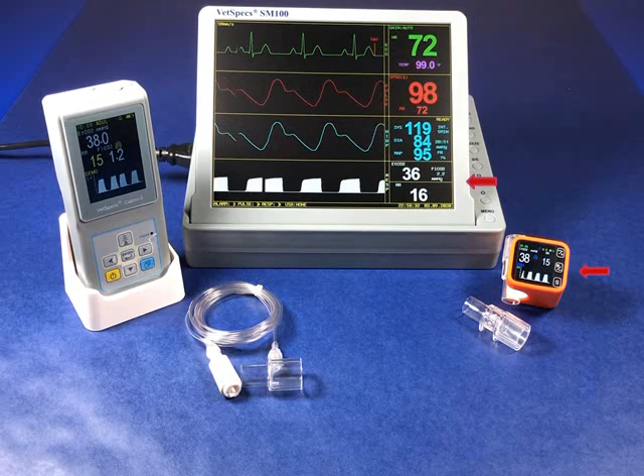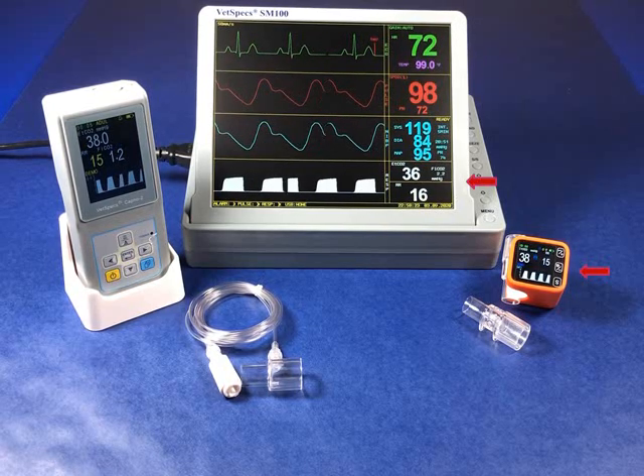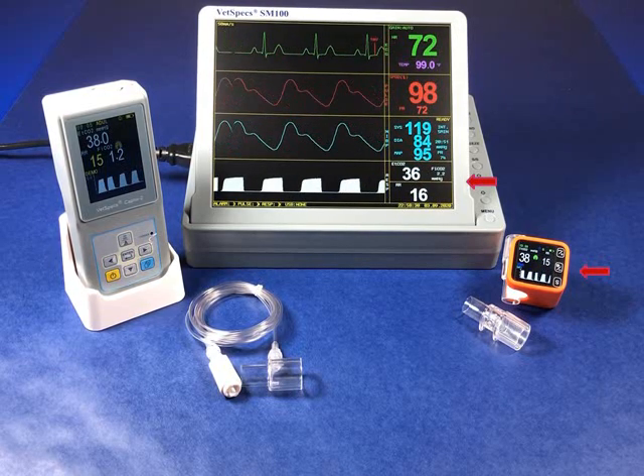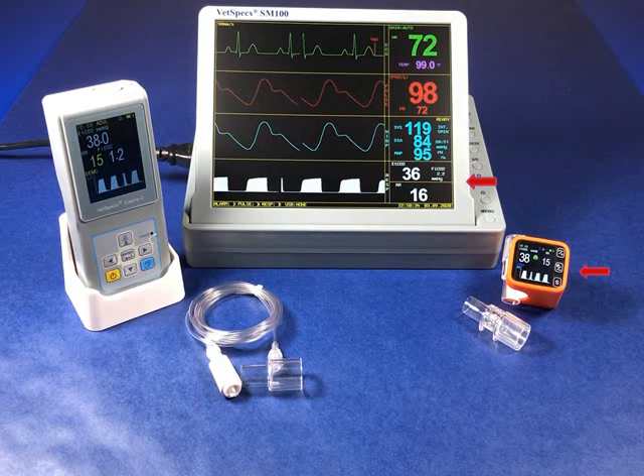Furthermore, the miniature CAPNO-M, featuring mini-CAP mainstream technology, offers remarkable portability for use in pre-, intra-, and post-operative applications in which intubated patients are more likely to be moved from the prep area into the surgical suite, and then onto recovery.